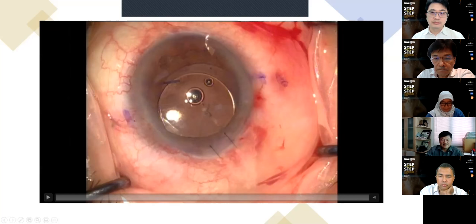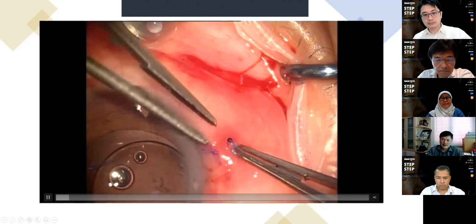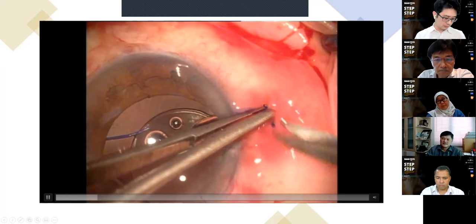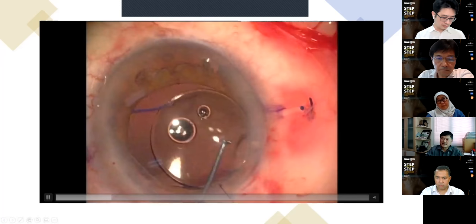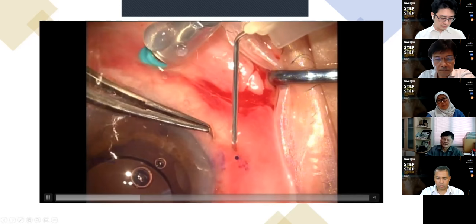the modified Yamane technique. After I push in both ends of the haptic, I feel that the lens wasn't actually in a very central position. So this is what I'm trying to show you, how we can actually modify and adjust the haptic. One of the haptics, I retrieve it, pull it out, and then I chop off the flange. Okay. Then using a reverse Sinskey hook, I try to pull the haptic back into the eye, and then I try to make the haptic into the AC, but couldn't make it, so I just leave it there.